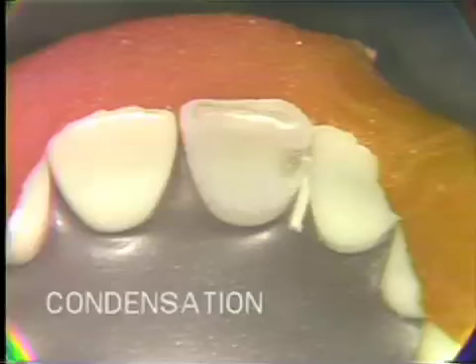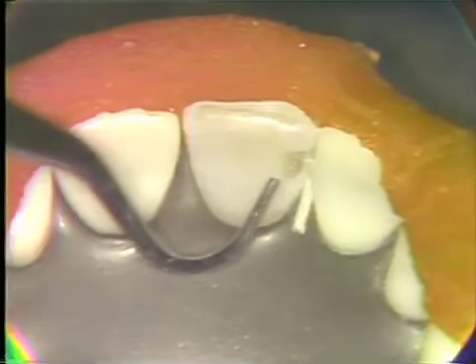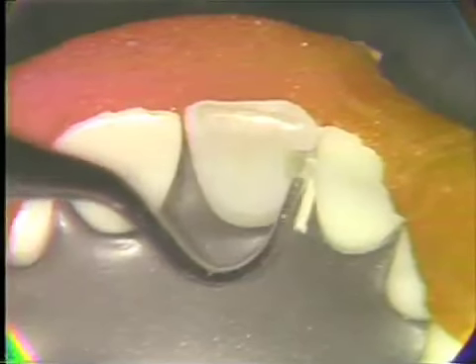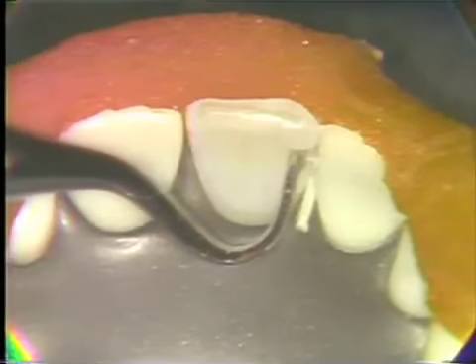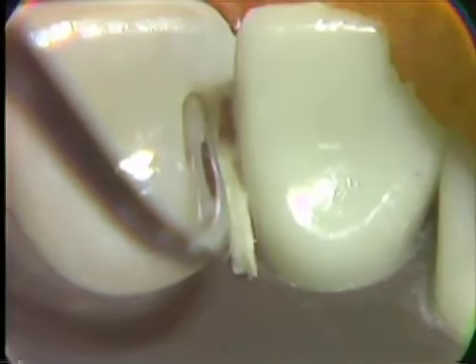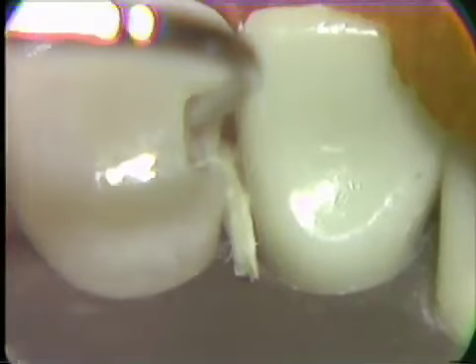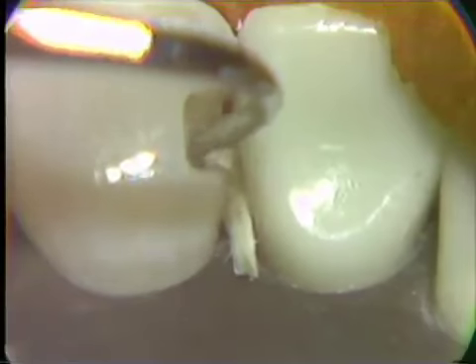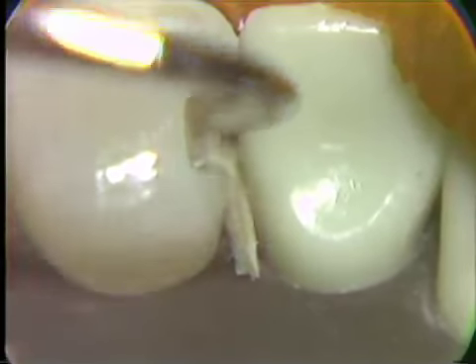In considering condensation, we would like to test the various condensing instruments. We have one that we can initiate condensation with, and we can see that as we approach the preparation, this fits into that incisal area well, and also fits down into the lingual cervical position and across the cervical floor to the labial area.